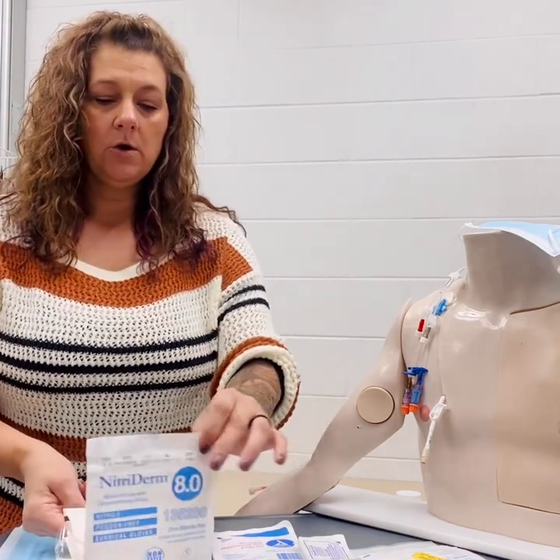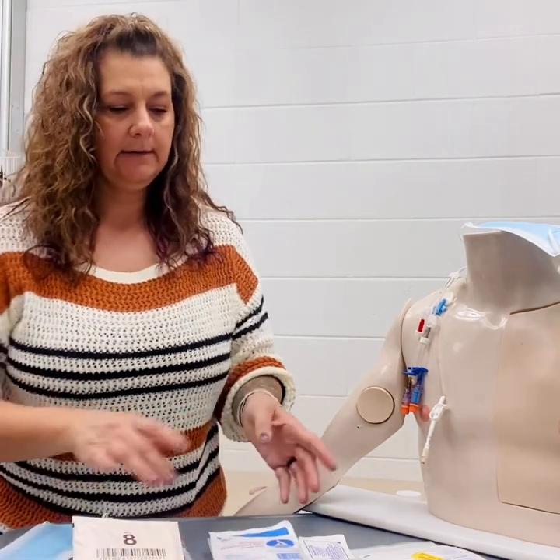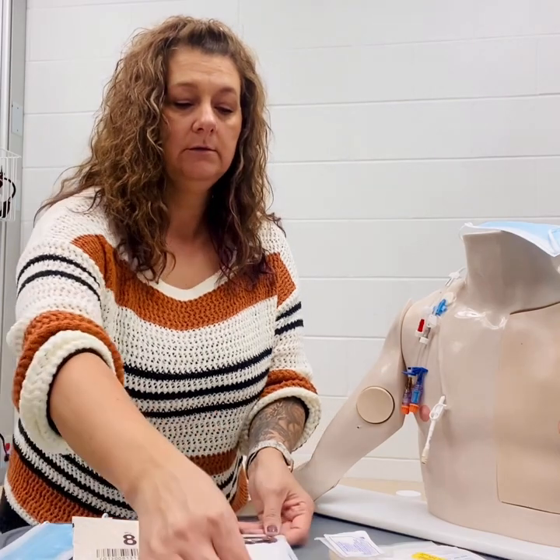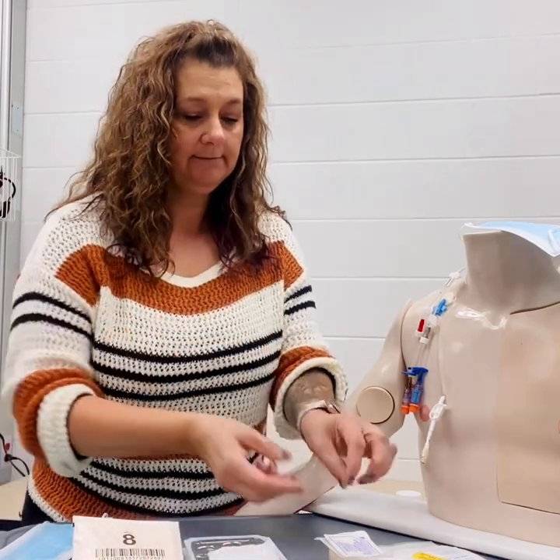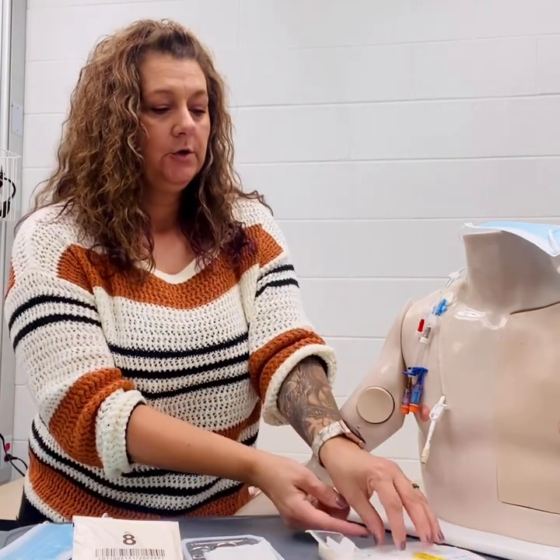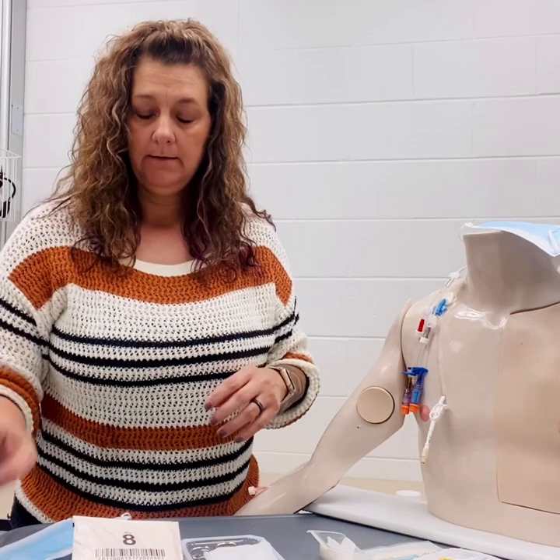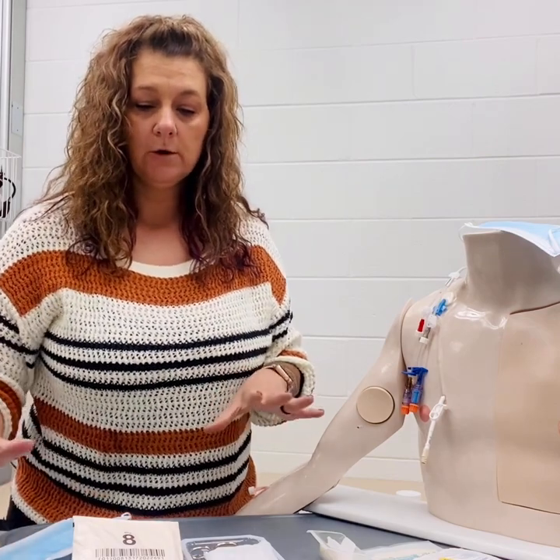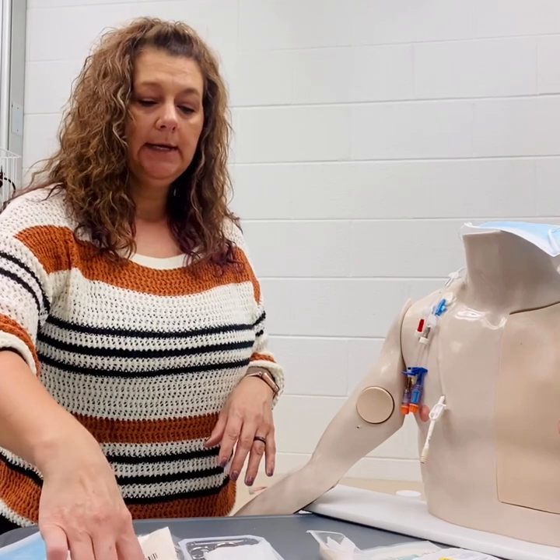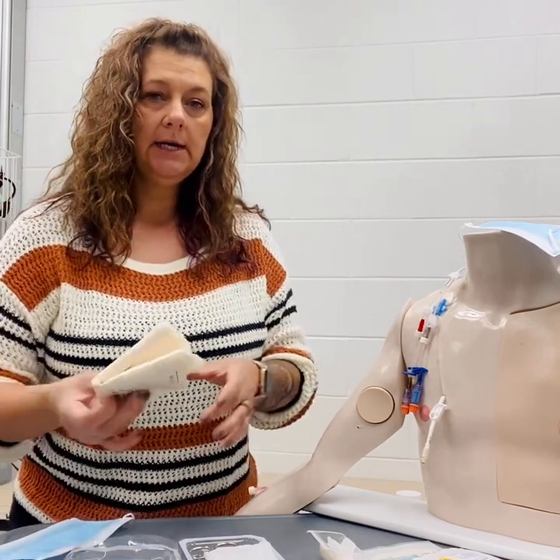Then we would want to start opening our sterile supplies. We can open our sterile gloves and we'll do all these in sterile fashion. Open your chloroprep, your sterile dressing and your Tegaderm, and then we'll have our tape ready for the end of the procedure as well. Then we want to don our sterile gloves.